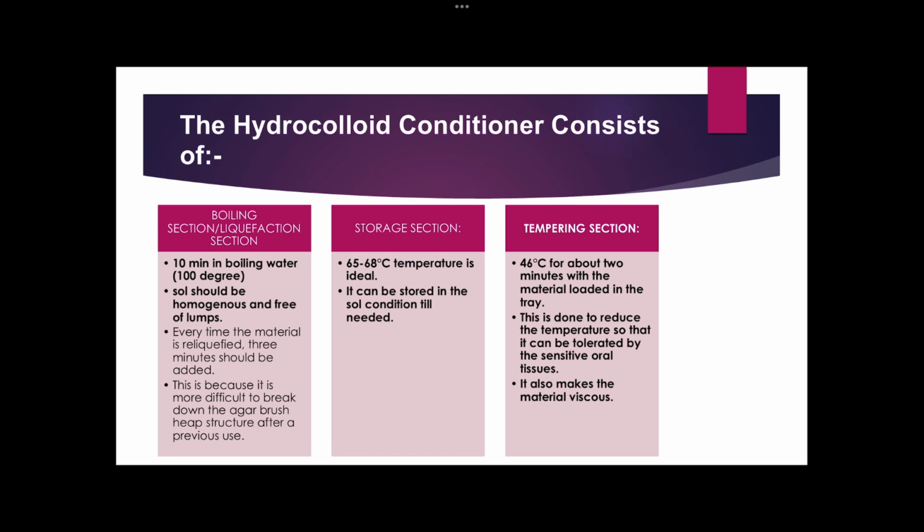What does this line basically mean? It means that an additional 3 minutes should be added every time the material is reused. Why is it done? This is because it is more difficult to break down the agar brush-heap structure after a previous use. So it remains in that container for an extra 3 minutes so that it breaks down more easily.